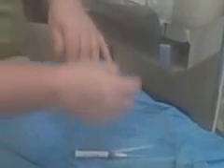At this point, I can set that needle aside, syringe, and let's give our local anesthetic a few cc's to work. As I say, since I haven't actually been able to see my mark here, I'm going to confirm my position and get ready. We're going to go bevel up. We're going in slightly cephalad. Alright, we can go in. We'll definitely introduce her.